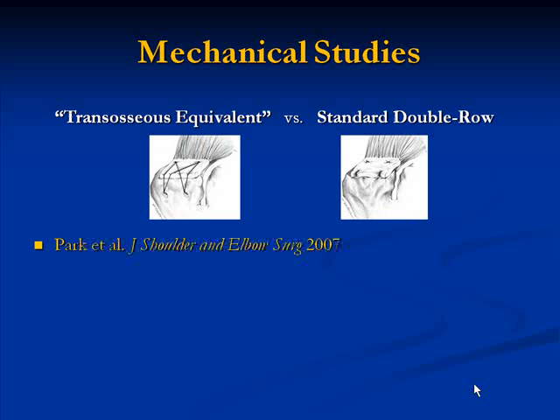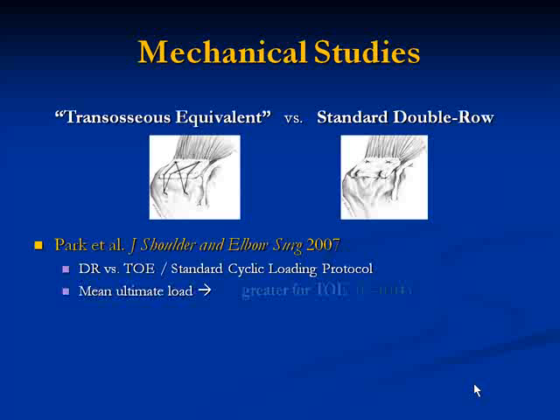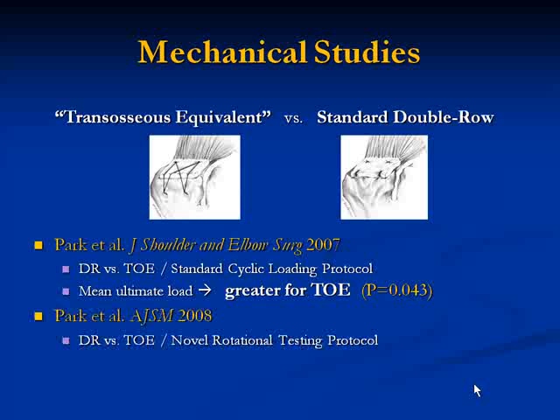Now, Park and colleagues have done a number of mechanical studies on transosseous equivalent, and with a standard cyclic loading protocol, they've shown that the transosseous equivalent was actually stronger than the standard double row. In another study using that rotational testing method, they also showed superiority of the transosseous equivalent.